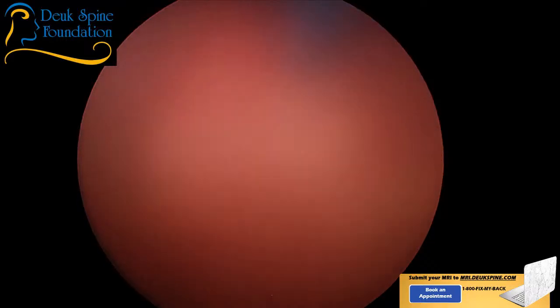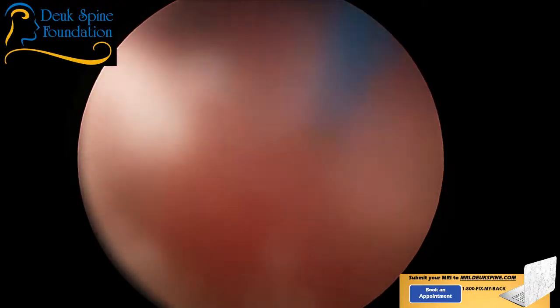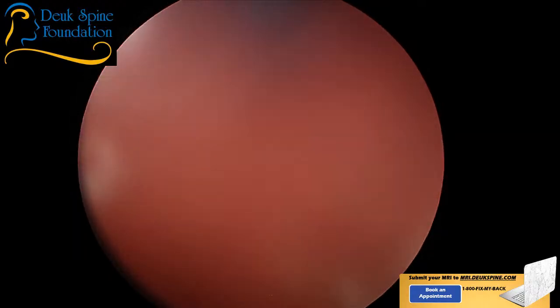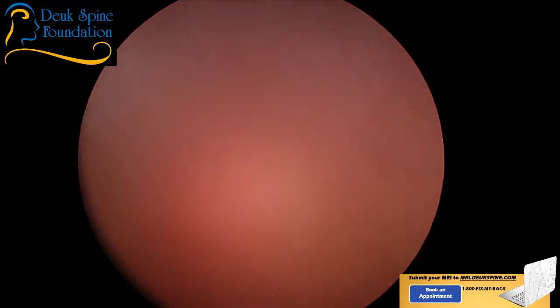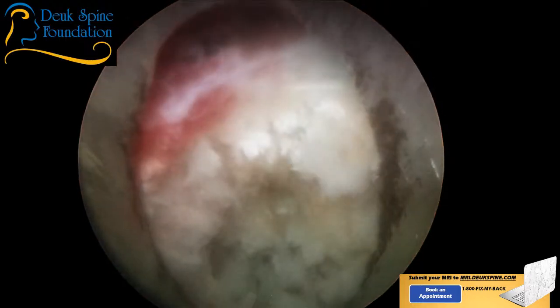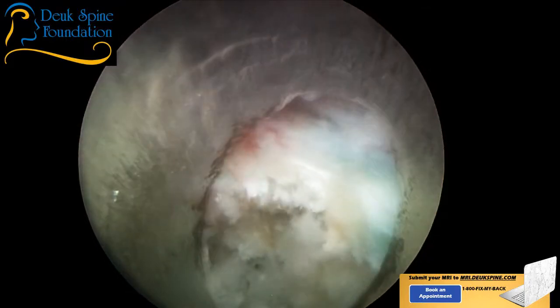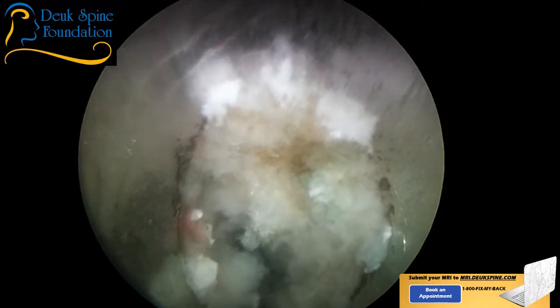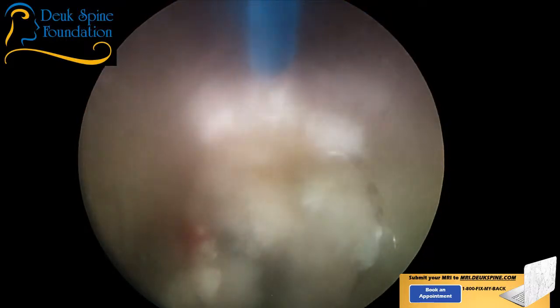So we're getting a little bit of particulate matter from the herniation that I'm zapping away at, and that's what's also clouding the view, but most of it is just red blood cells. Again, you can see the epidural vein. We're just about outside the disc. I'm pushing back in a little bit. Just finish this last section up and we'll be done.